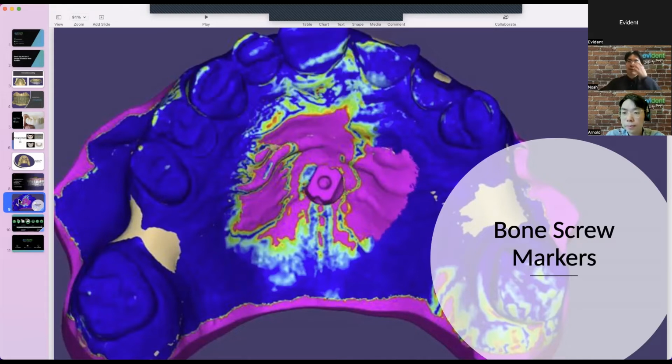Yes, I think you touched on something interesting there, Arnold. It's actually funny, I had this conversation with a clinician earlier this morning. I think you have to understand the problem you're trying to solve for your patient with a temporary or with an immediate all-on-X. Ultimately, we're just not at the point in terms of resin technology where it is going to be a permanent restoration.